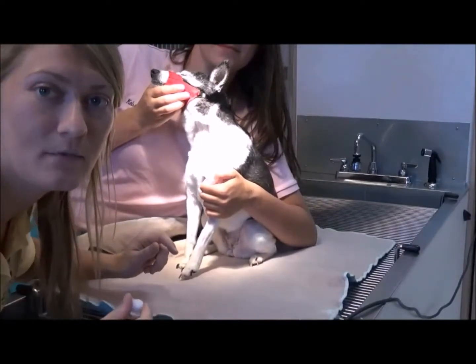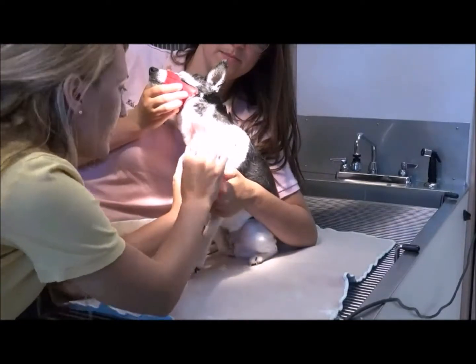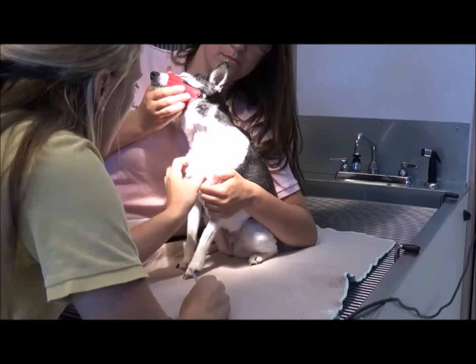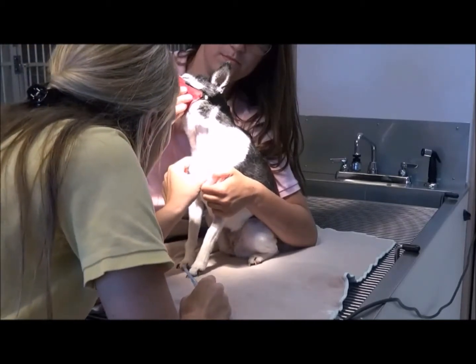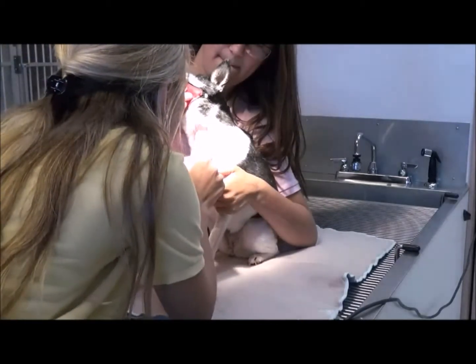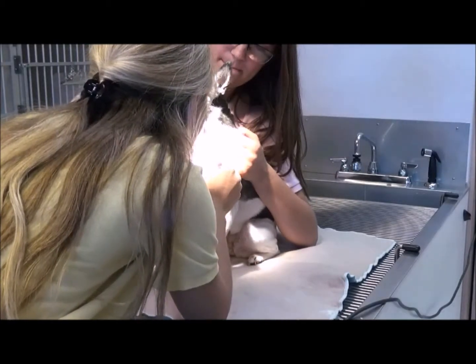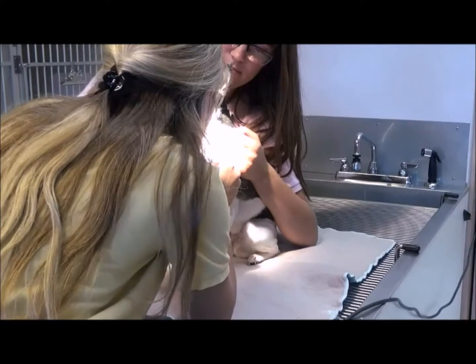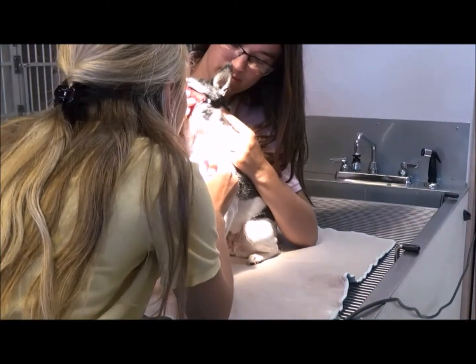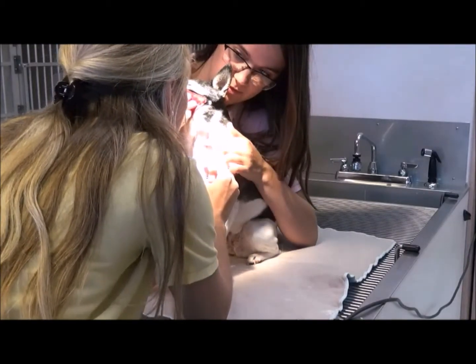Okay, now I'm going to get a blood sample from the jugular vein of our canine patient. I've already pre-clipped the area, and now I'm just cleansing it with an alcohol rub. His head up just a little bit. Good girl, P. Good girl. Beautiful. Okay, now Kelsey, I'll have you put your finger over the needle edge and we're going to pull out there a little higher. Perfect.